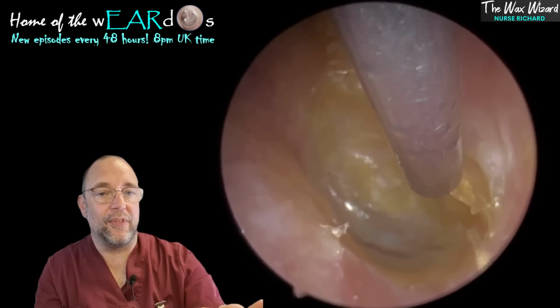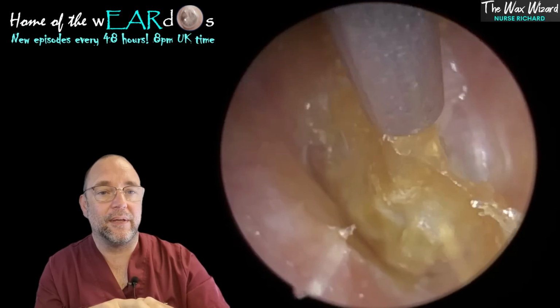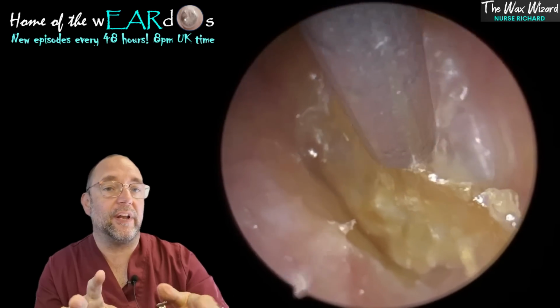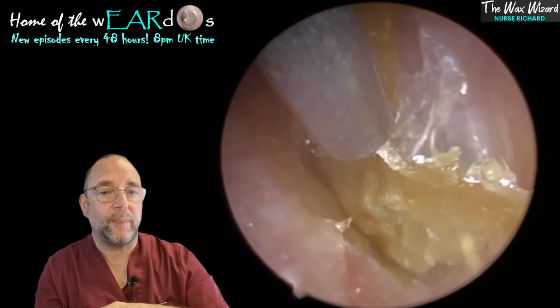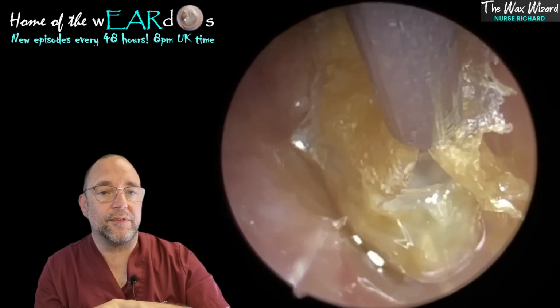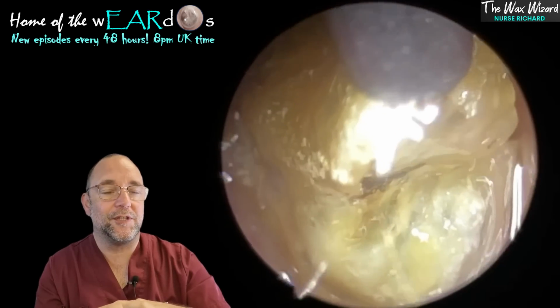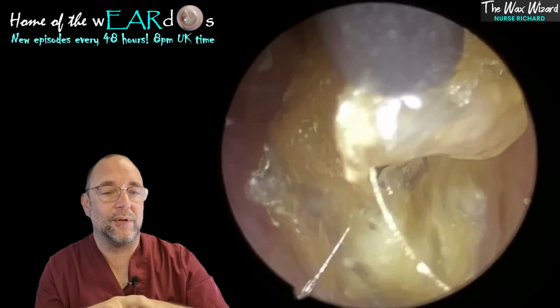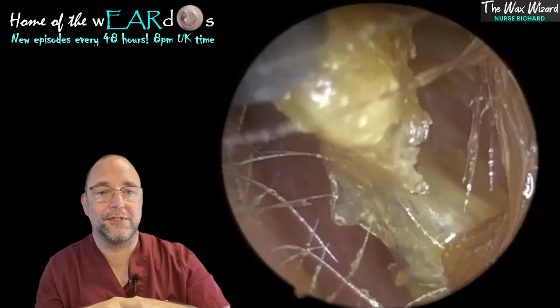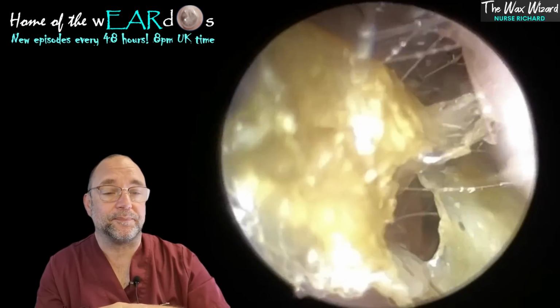Have a look how this thing comes out. It's absolutely beautiful. Have a look at it peeling away. It's been a little bit stubborn there. So I'm just trying to get that flat surface, but look at this. It's so nice when this happens, and you don't have to maul around on the eardrum for too long, because it's very dangerous stuff, sticking little steel rods near someone's eardrum. So the shorter time you can spend down there, the better.